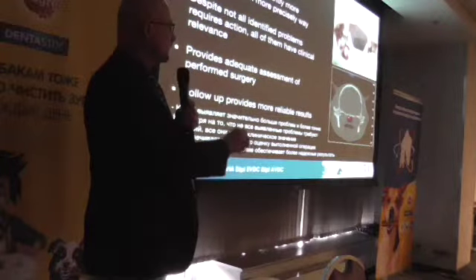But we can see that there is a condylar fracture of the left temporomandibular joint here.